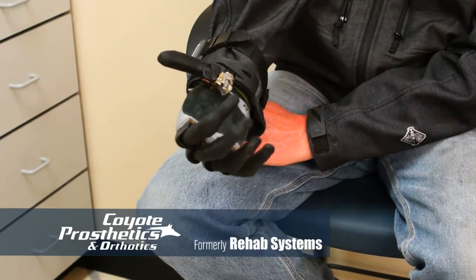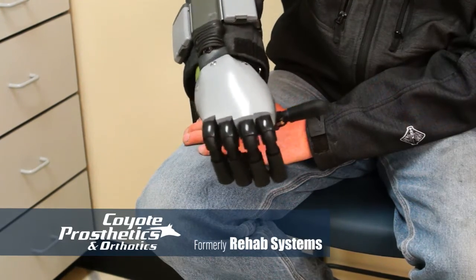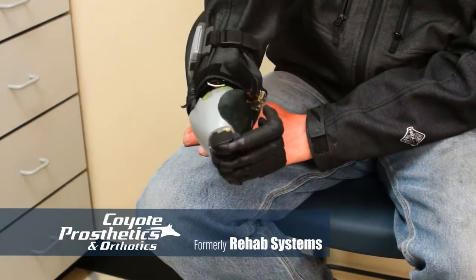I still have a short piece of my thumb and a short piece of my hand, and complete function of my wrist.